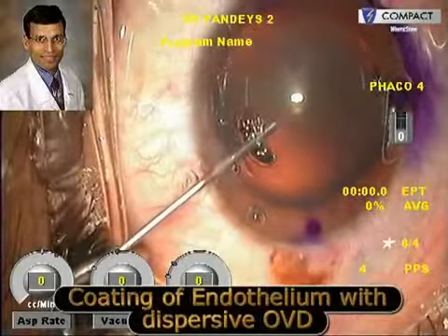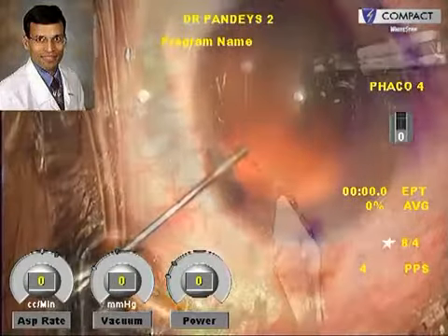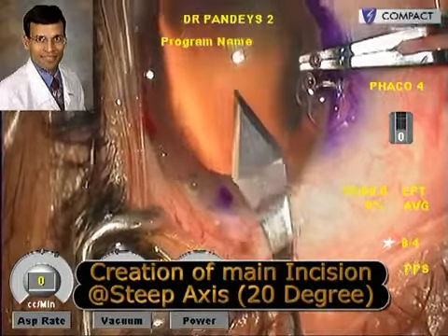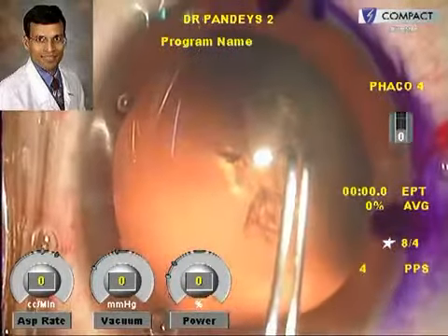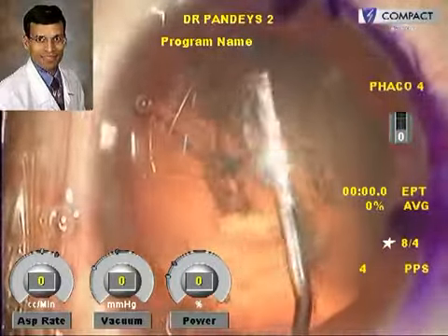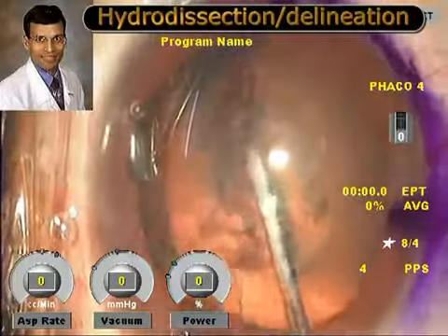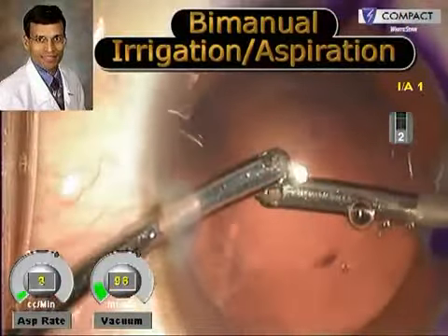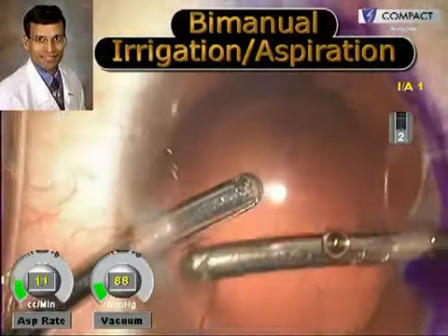We then coat the endothelium very well with a dispersive ophthalmic viscoelastic device. The main incision at the steep axis and the sideport incisions are made, and a good capsular rhexis — crucial for all refractive IOLs like toric and multifocal — ensures perfect centration within the capsular bag. Bimanual irrigation aspiration was done; this was a soft lens so phacoemulsification was hardly needed.